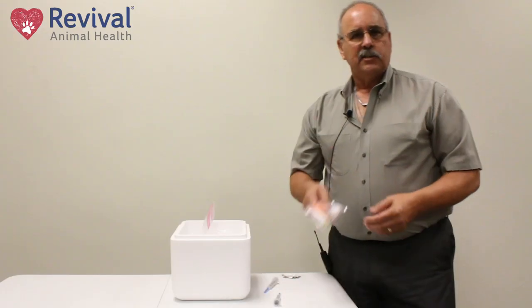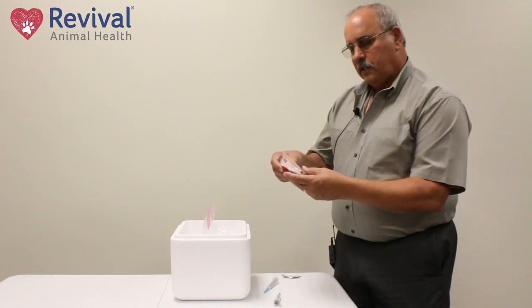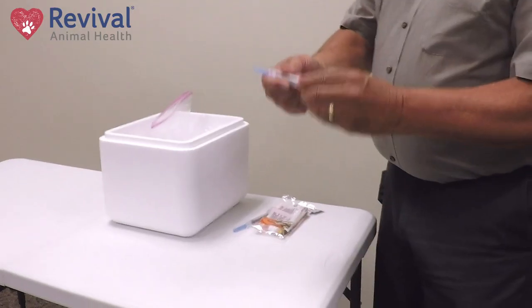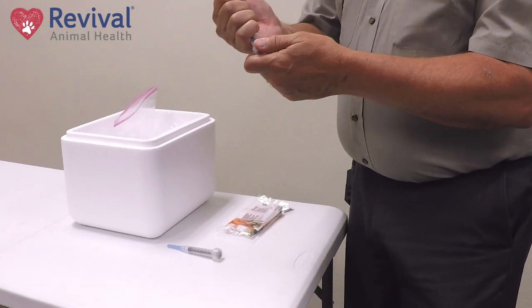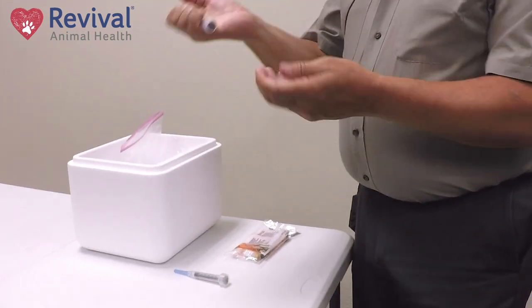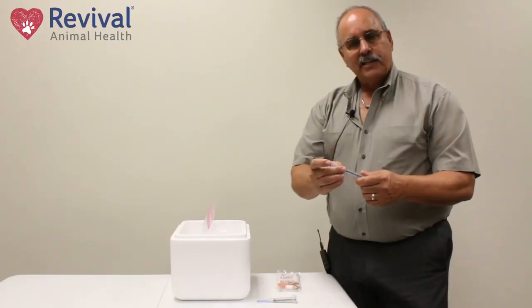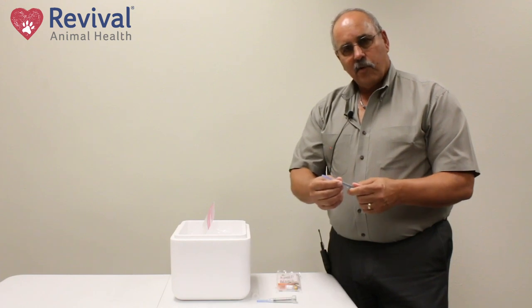When you get a vaccine in a single dose, you'll have the syringe inside the package that contains your vaccine and your diluent. You'll oftentimes have a closed case and you can snap those by twisting them, but if you have trouble just pop them down on a table and it'll snap apart. You can push on the needle and bring it out. These are called luer locks and they actually lock your needle in, so just make sure that's tight before you use it.